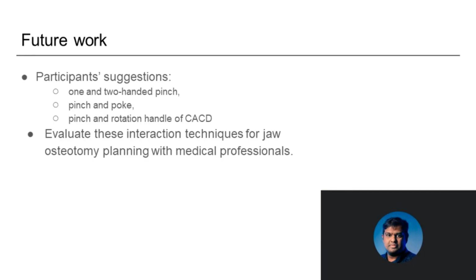In future work, we are planning to further iterate on these interaction techniques based on the participants' feedback. We are planning to implement the following combinations. 1. One or two hand pinch. 2. Pinch and poke. 3. Pinch and rotation handle of CACD. We are also planning to evaluate these interaction techniques for jaw osteotomy planning with medical professionals.